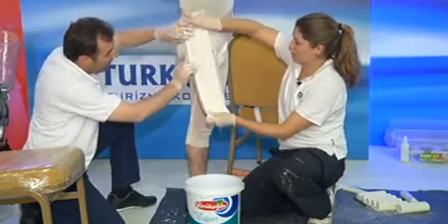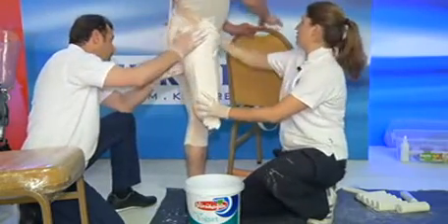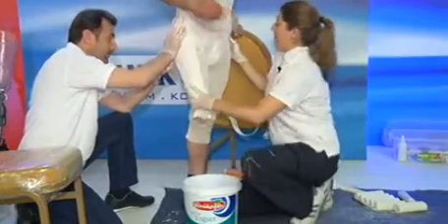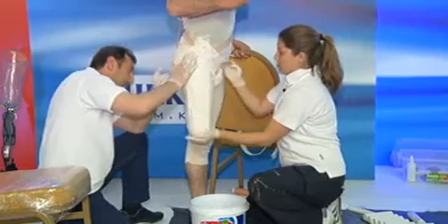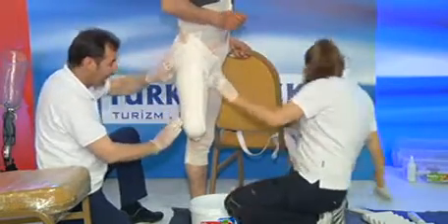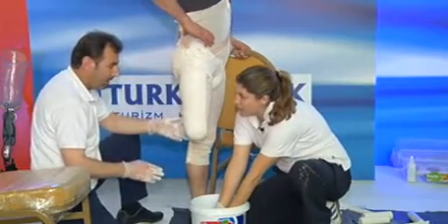We just put the lateral slab on as well, making sure that you bring it closer. Facing me. Making sure that our pelvis is okay, that he's not lifting it. Okay. And then we start to cast around the pelvis.